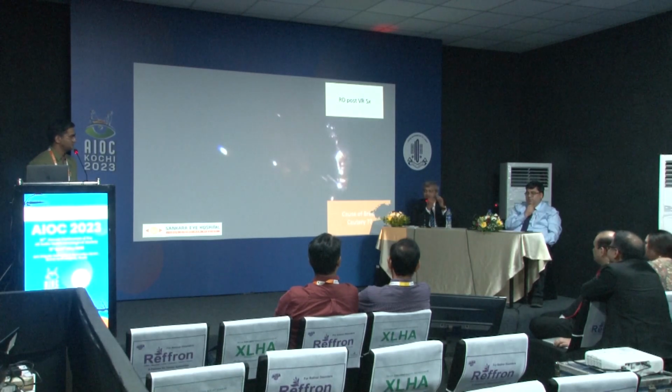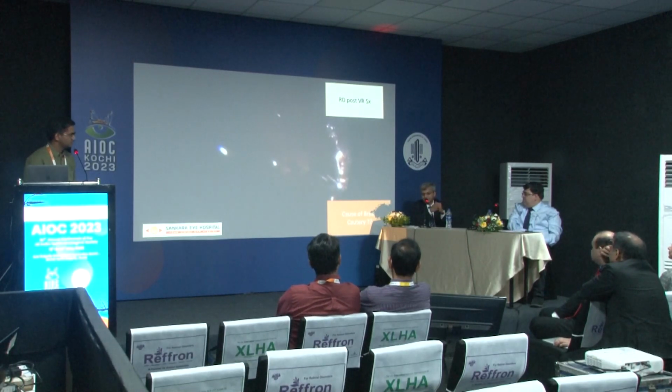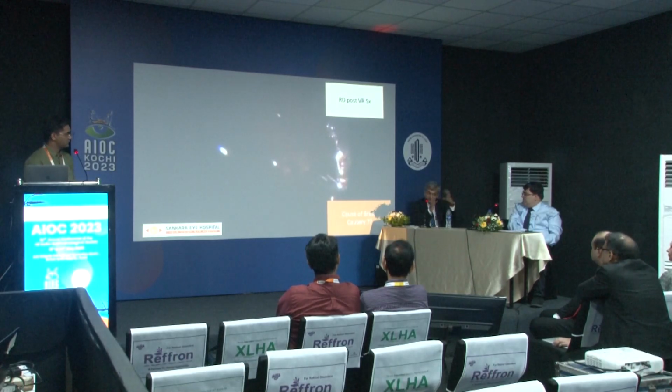A pop coming out means you have created a break, and if you don't tackle that, you have to keep on enlarging the area of laser. If that is not assessed immediately and you don't take action, so if there is an elevation, don't try to laser on top of the elevation. If there is hemorrhage, that's why we say earlier, for focal lasers, don't do laser in the area of retinal hemorrhage, because the hemorrhage will absorb the laser energy and create a break.